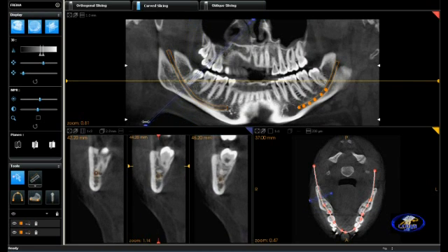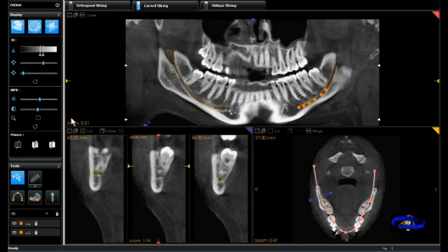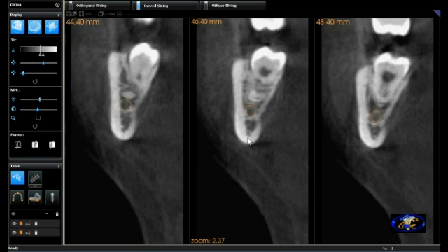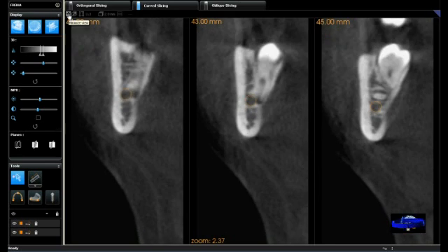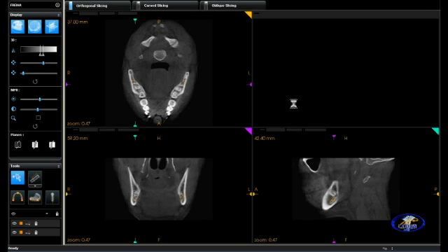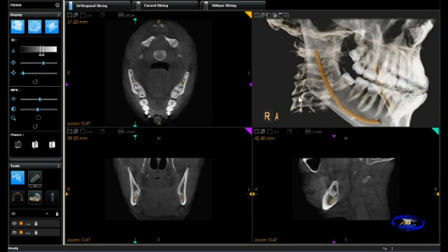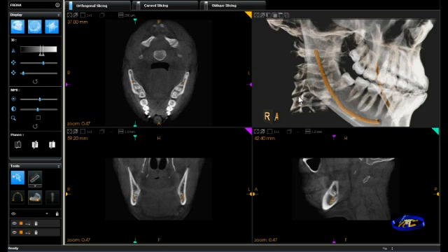We'll enlarge those in a 1-by-3 format of the cut planes, which allows us to scroll slightly and observe that relationship — which in this case is very, very close. At this point we'll go back to orthogonal slicing, which allows us to visualize the nerve canal in the three-dimensional volume. The nerve canal is also clearly visible in the axial, coronal, and sagittal views. That concludes the short presentation on this particular patient and how three-dimensional imaging helps to better visualize anatomy.